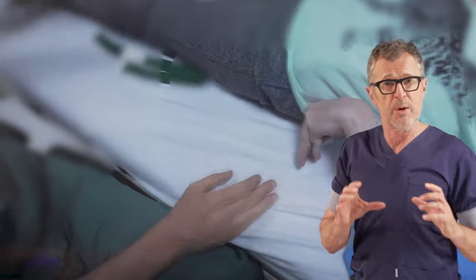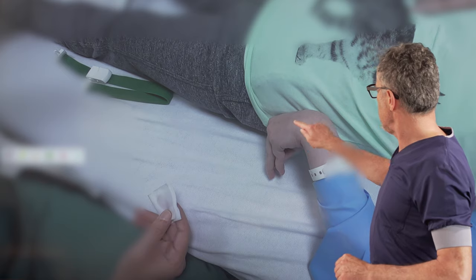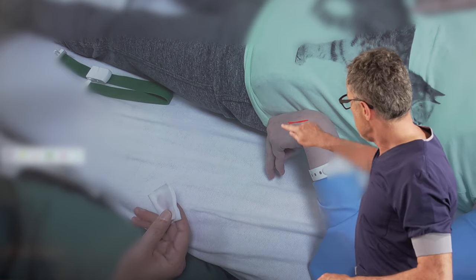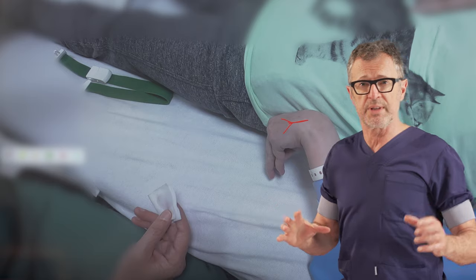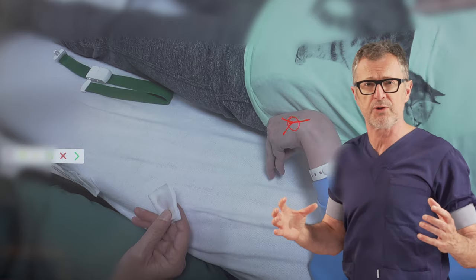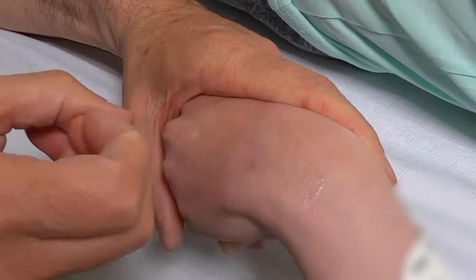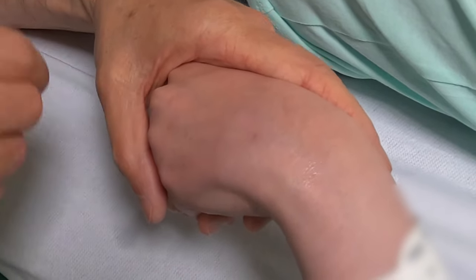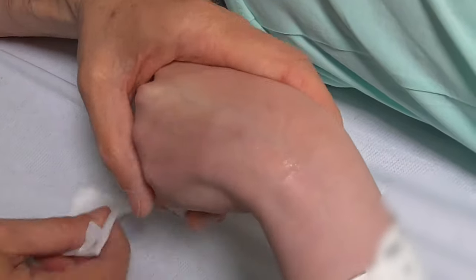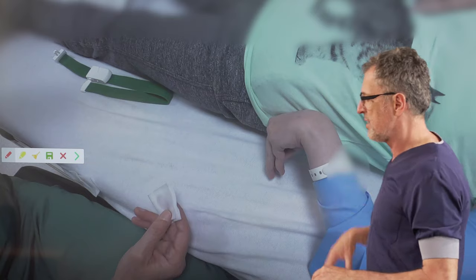Here we can see one peripheral vein, and we're going to choose the one that has contributories. If you choose a vein that's fairly visible or palpable but has distal contributories, those contributory veins distally tend to stabilize the point of venipuncture, making it a lot easier to stabilize the vein and insert the catheter. You can imagine how doing IV access with these contractures is extremely difficult, and this particular technique has saved many aggravations in many different situations.